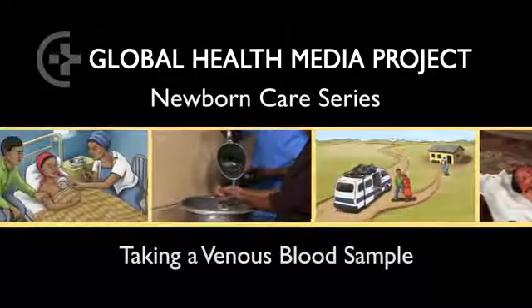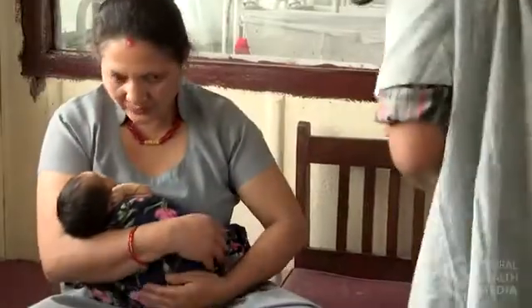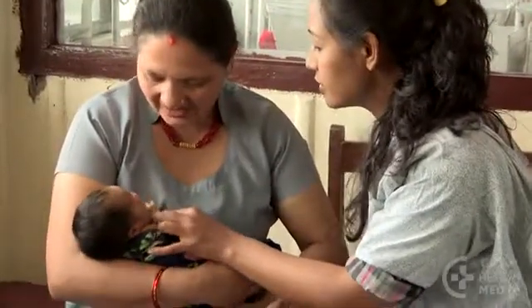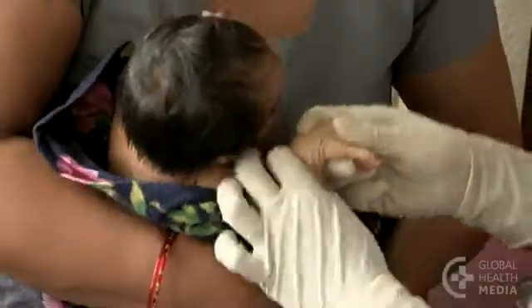Taking a venous blood sample. Sick babies often need several lab tests. If more than a milliliter of blood is needed, blood should be taken from a vein.